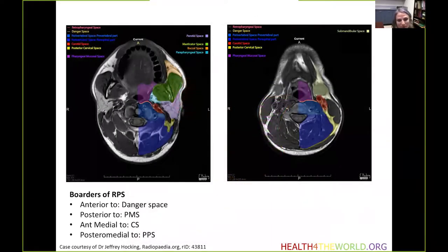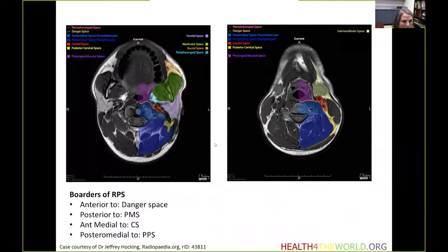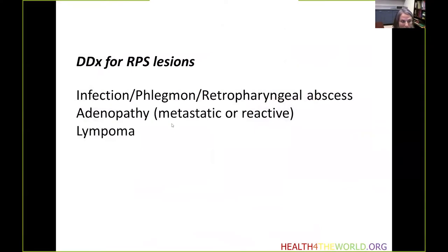The retropharyngeal space is bordered by the pharyngeal mucosal space anteriorly and the perivertebral space posteriorly. The differential diagnosis for retropharyngeal lesions includes infection, phlegmon and abscess formation, adenopathy whether metastatic or reactive, and lymphoma.